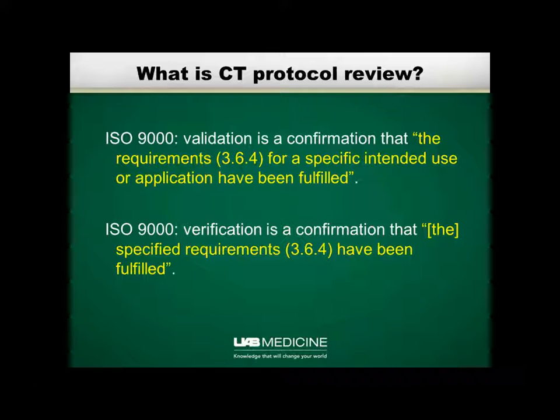Verification is the hard part of all this, making sure that what's on the scanner is what you intend to be on the scanner. You can have a lot of people meeting twice a year, reviewing documents and protocols and so forth, but that's just wasted paperwork if the documents that you're working on don't actually reflect what's on the scanner.